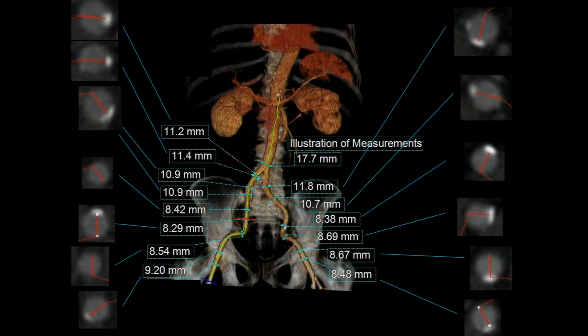When we first started doing this, I used to say that the delivery system was about the size of my thumb. It was huge. And now, several iterations of technology later, it's about the size of my pinky finger. So most people's arteries can accommodate that, but you don't want to take a risk. You need to know for sure so that you don't have a vascular complication.